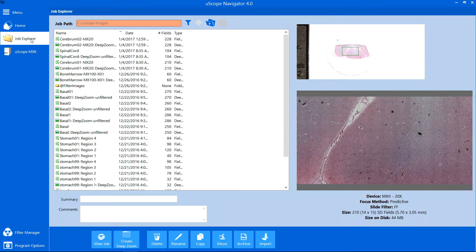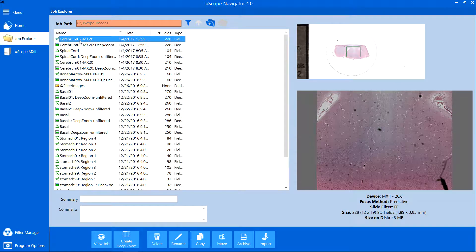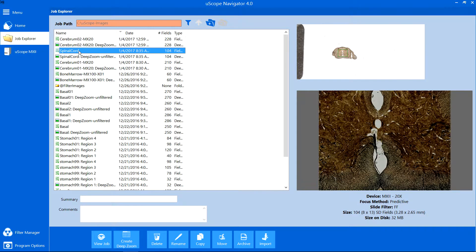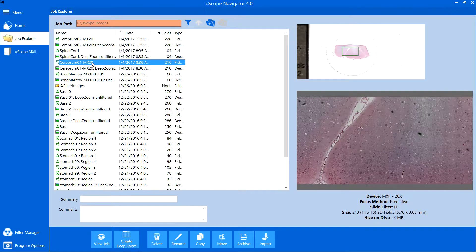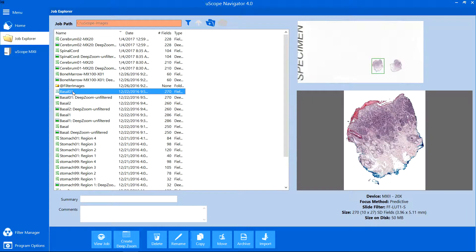The Job Explorer tab displays all of your scans and deep zoom images. From this screen, you can open and view your images, edit or change job information, rename, copy, and delete jobs, and archive and import jobs.